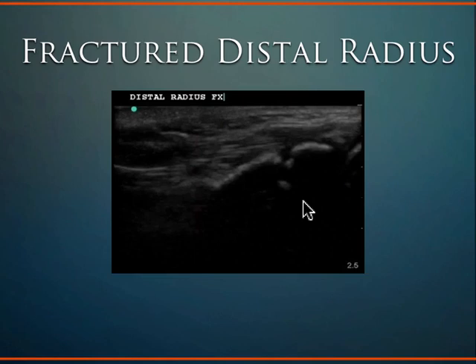So when you're doing an ultrasound, you put so much gel on it. You can get gel out of the refrigerator. I always keep the bottle in the refrigerator, so you can put some chilled gel on there, and then you don't even touch the skin. The ultrasound touches the gel, and then it's actually painless to do an ultrasound for a fracture, as long as you're not moving the bone. Once you start moving the bones around, then the patient will let you know about it. For sure.